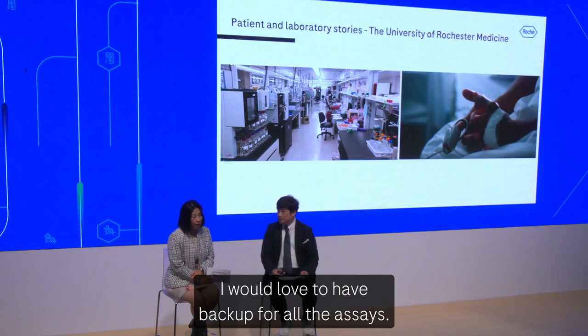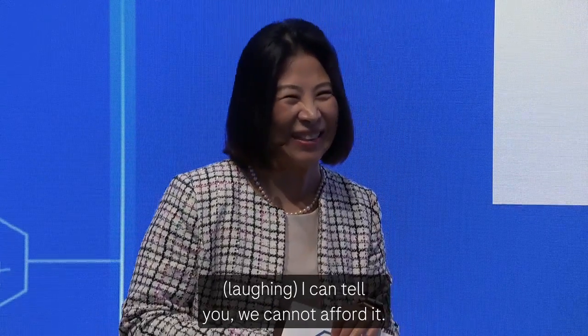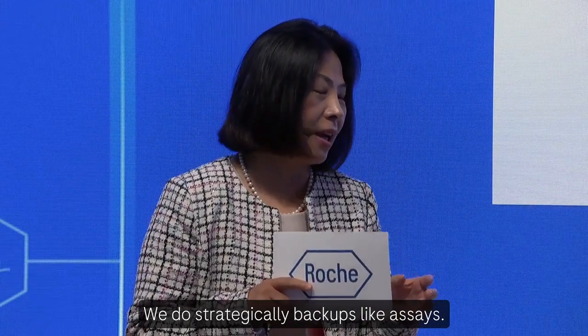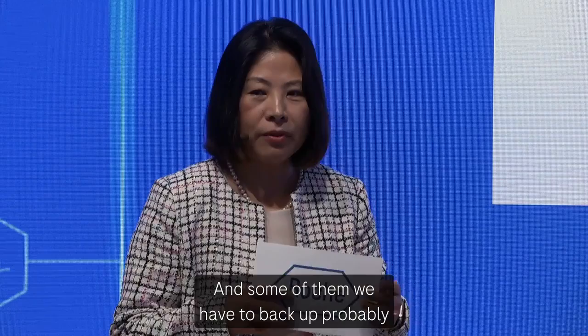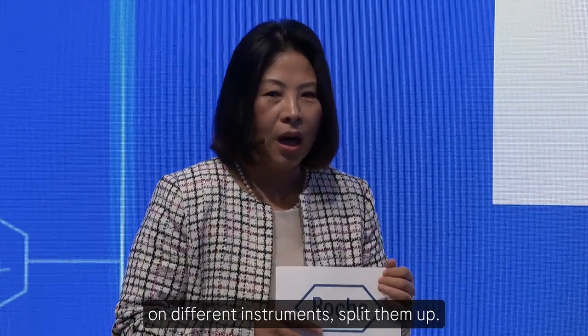I would love to have backup for all the assays, but we cannot afford it. I can tell you we cannot afford it. We do strategically back up some assays, and some of them we have to back up probably on different instruments, split them up. We have to be creative.